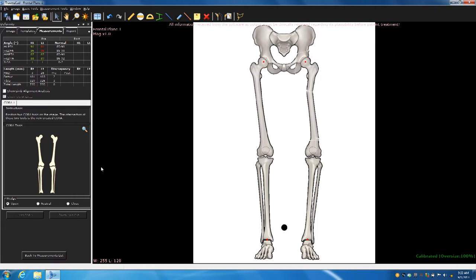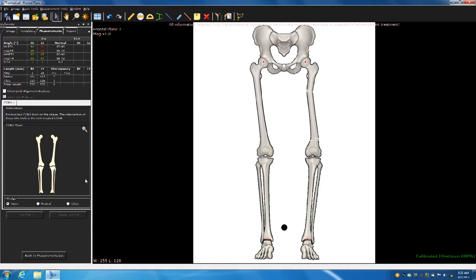Let's go on and find out where the deformity is and correct this bone. This is where we have the decoder ring. In the years past, the CORA tools, these are now what you, in your mind, you would call them apex tools. Same things. CORA, center of rotation of angulation. The ACCA, the axis of correctional angulation, I mean, it's an apex. It's a point. The ACCA is a hinge point. It's just a thumbtack. It's a little bit simplified, and that's okay. I accept the fact I'm simple-minded.